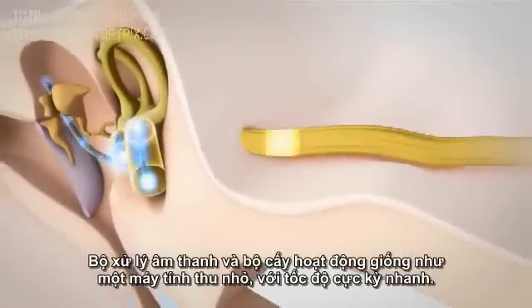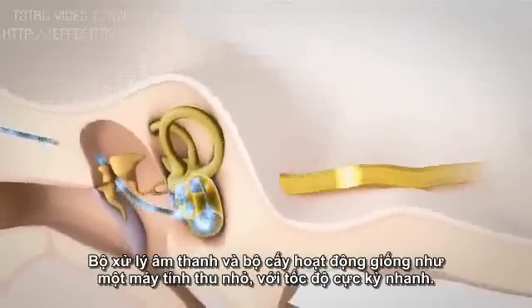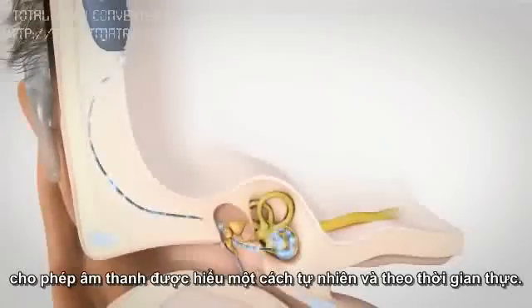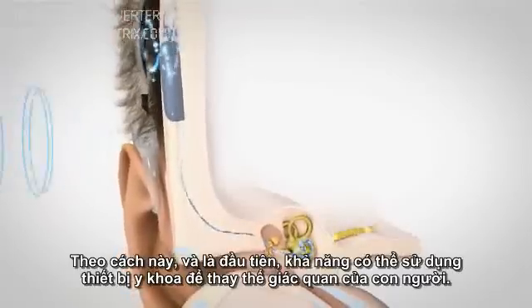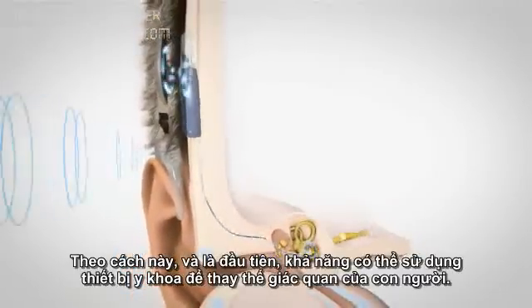The audio processor and the implant work like an extremely fast miniature computer. They are constantly processing an immense amount of acoustic data, allowing the sound to be perceived naturally and in real time. In this way, and for the first time, it is possible to use a medical device to replace a human sense.